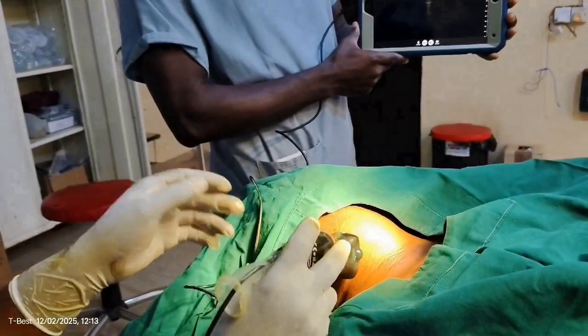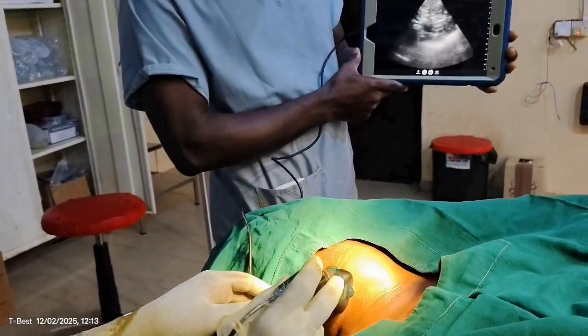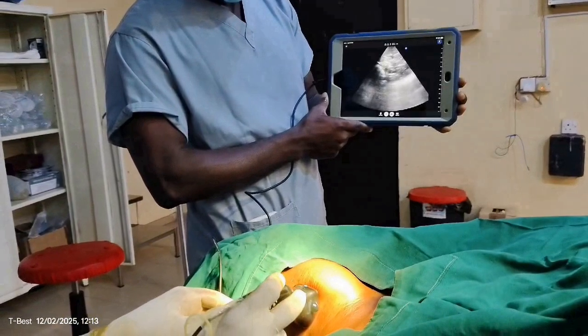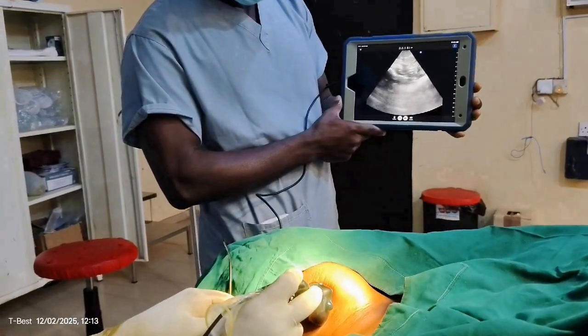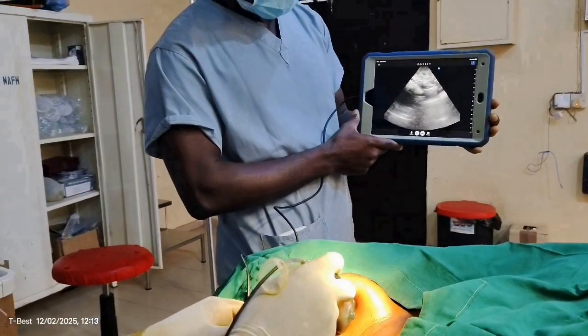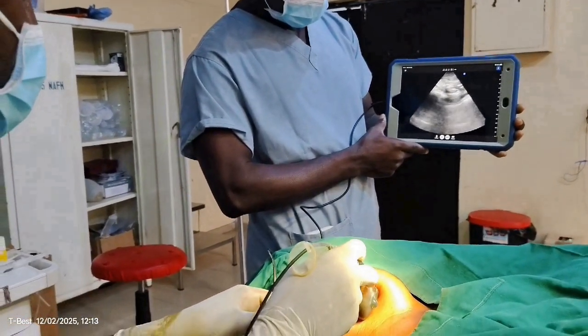The ultrasound has been prepared — the Butterfly IQ. So we're putting this here. I'm going to put this from lateral, looking for the muscle. Okay, so these are the vessels there.